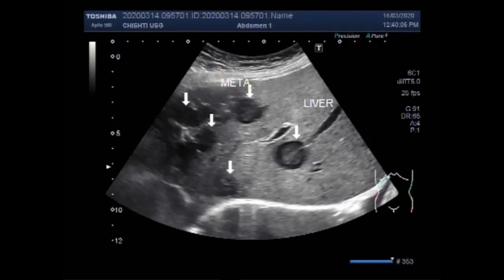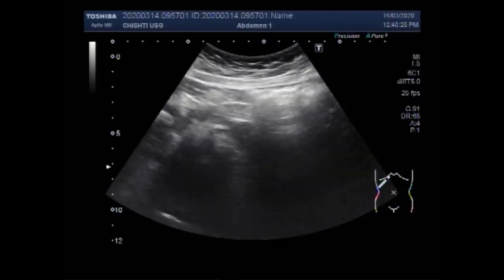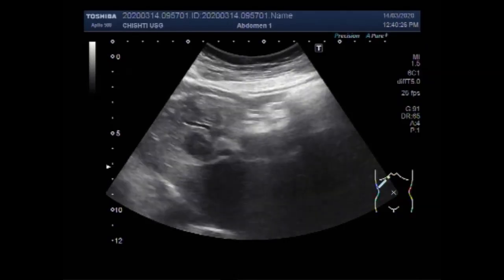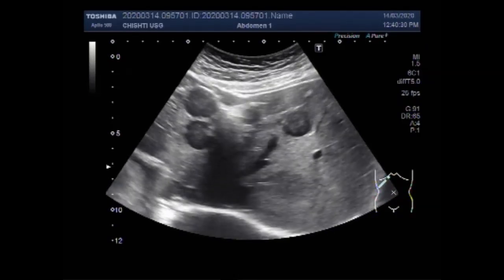A liver metastasis is a cancerous tumor that has spread to the liver from a cancer that started in another place in the body. It is also called secondary liver cancer. Primary liver cancer originates in the liver and most commonly affects individuals who have risk factors such as hepatitis or cirrhosis.